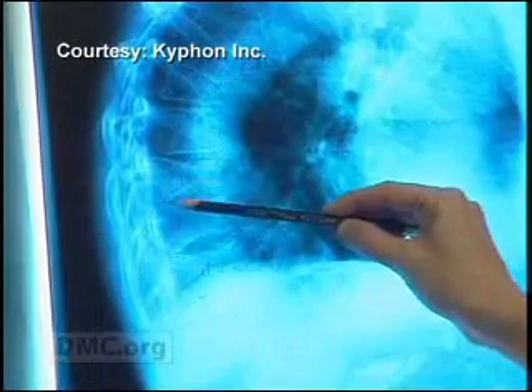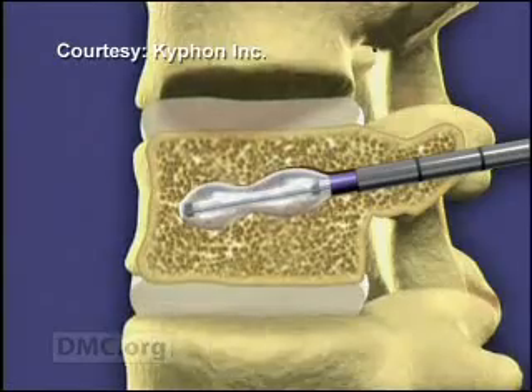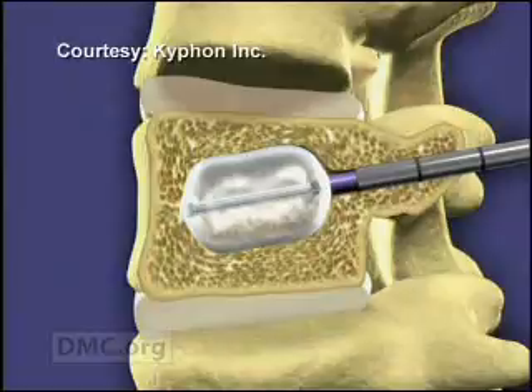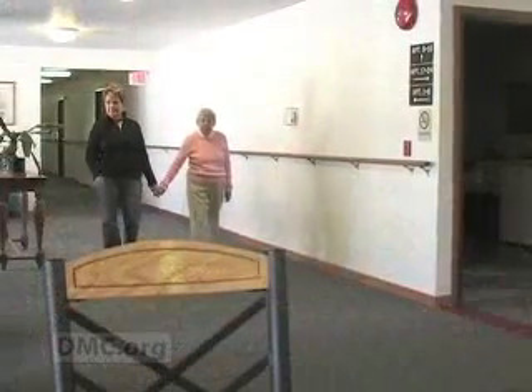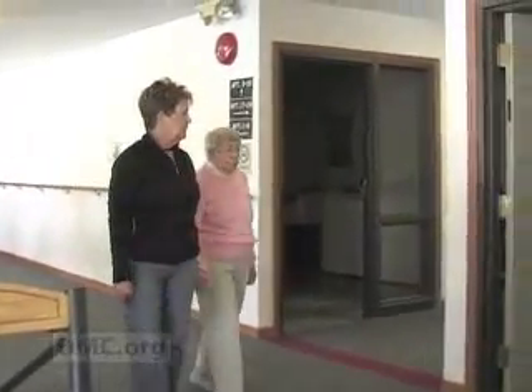Dr. Wolfe told Eleanor she was a good candidate for the minimally invasive balloon kyphoplasty procedure. Orthopedic balloons are used to gently elevate the affected bone fragments in the vertebrae in order to return them to the right position. But at her advanced age, Eleanor was concerned about possible paralysis. "I wanted to be assured that I'm going to be able to walk for at least five or ten more years. He told me there was no fear — he said he'd done it before and there was no fear of being paralyzed."